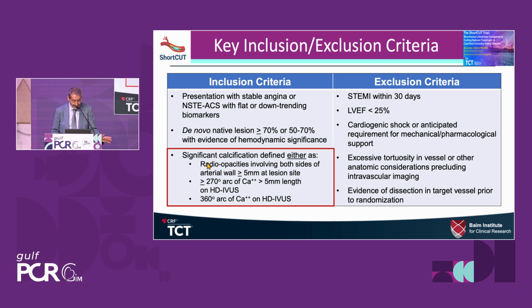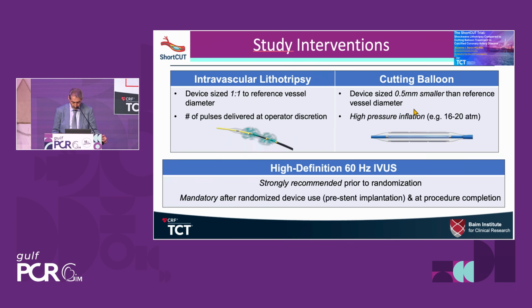And as you can see, the inclusion criteria was mainly angiographic. Also, it was considered the possibility of using the classical intravascular ultrasound criteria, but they were not truly the same as in the slide I've shown before. For instance, the diameter is not considered, and the vast majority of the cases were angiographically driven in terms of inclusion.